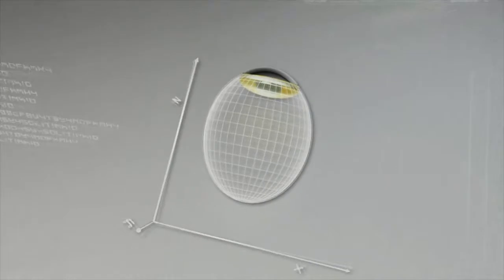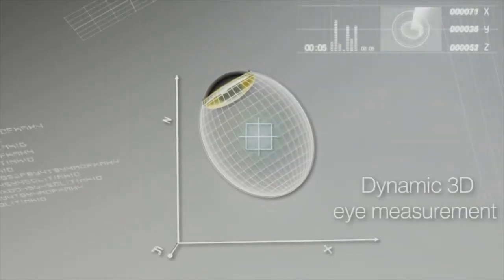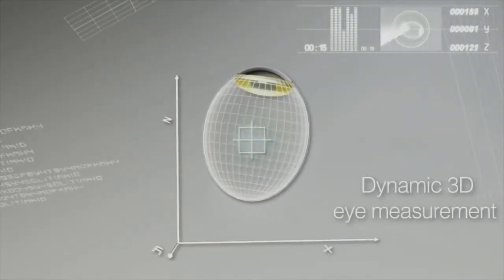For the first time, a live three-dimensional measurement of the human eye can be performed in your office, quickly and accurately.